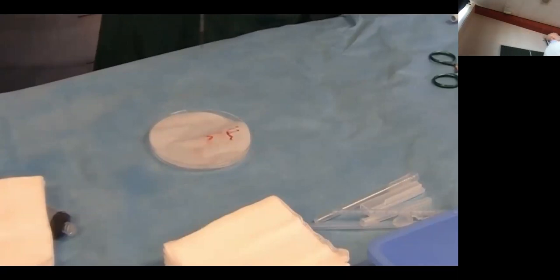The thing is, when a tumor starts to develop, you lose coherence and integrity with the environment. So all the structural information and architecture that used to be there is gone and becomes a random environment. All these cells are growing, basically the same cells, but the structure is a random kind of structure that grows there. And that's the noisy part of our data set. So that's where we actually are in the vital tumor environment, as we call it.